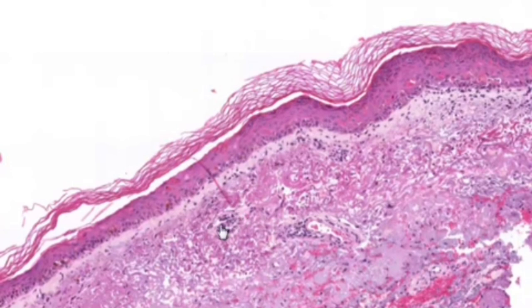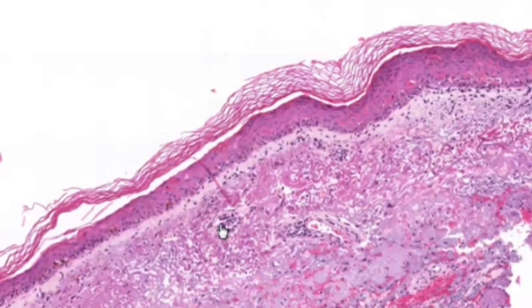You certainly may also see eosinophils as well, and this becomes a more important point in differentiating Erythema multiforme, say, from graft versus host disease. It would be very rare to see a significant number of eosinophils in graft versus host disease, but you may certainly see them in Erythema multiforme, although they are not necessary for the diagnosis.